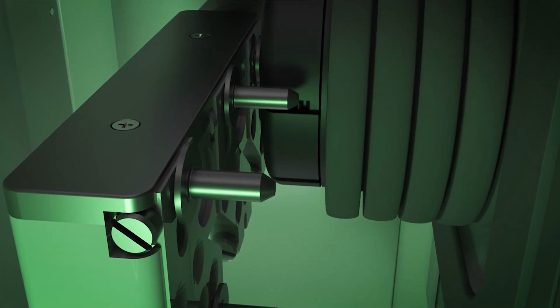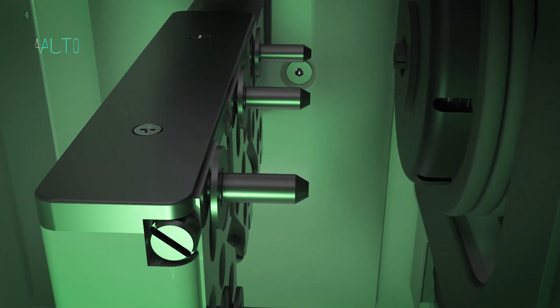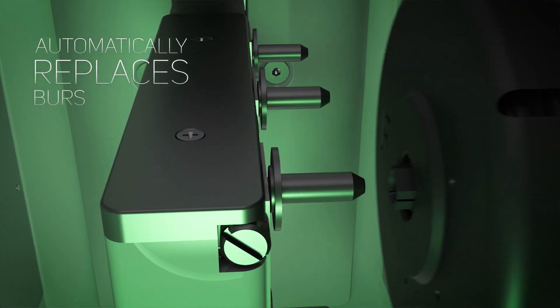System automation efficiently detects worn or broken burs, automatically replacing them for a refined, restorative finish.